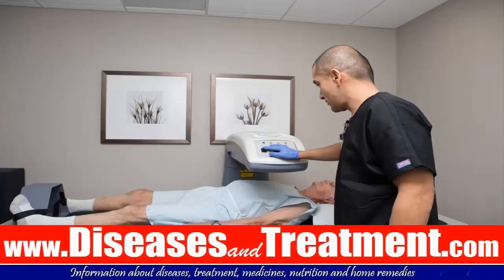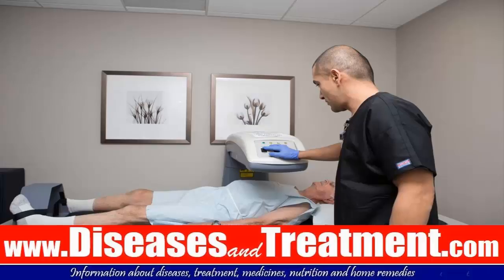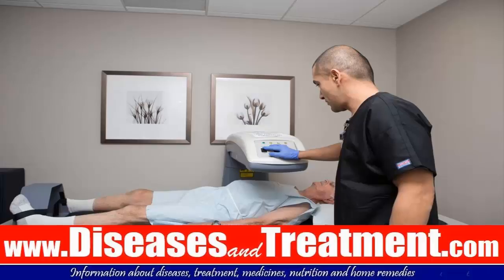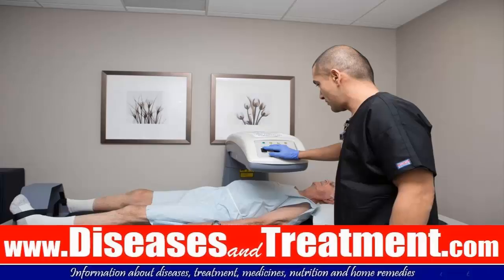Osteoporosis doesn't cause any symptoms until a bone is broken, so it used to be difficult to identify those at risk until a fracture occurred. However, it is now possible to measure bone density before someone gets a fracture. During the DEXA scan, x-rays are passed through your body — some radiation is absorbed by the bone and soft tissues, and some travels through the body to special detectors in the scanner which measure how much radiation passes through your bones.